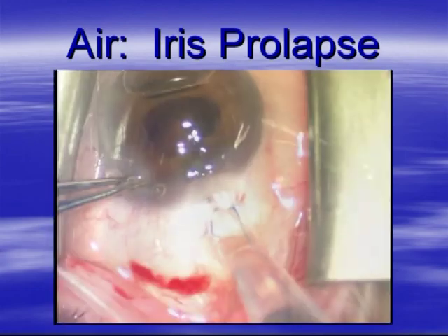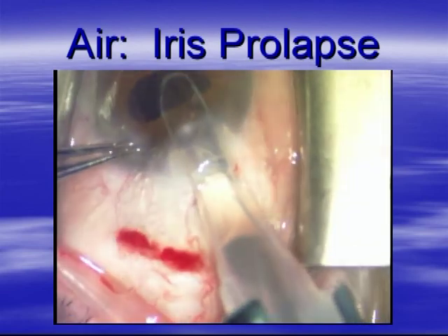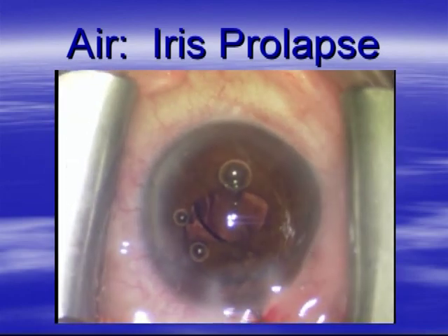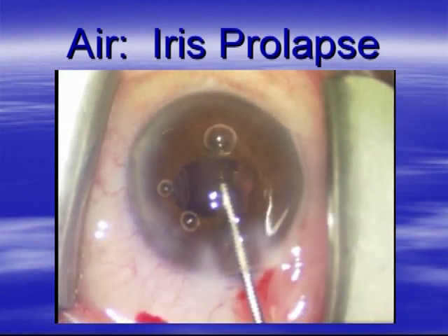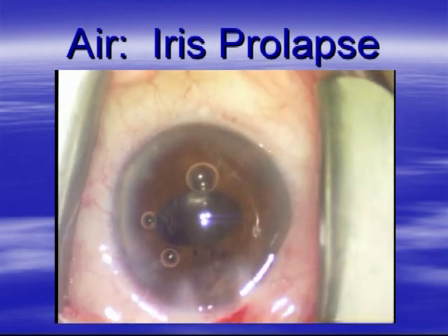We put the tip of the injector in, rotate it appropriately so we don't incarcerate the iris or catch it as we inject the IOL. And the IOL goes into the capsular bag, not in one step, but very good. And now we can actually manipulate the Lester hook, put the lens in the bag without any difficulty. And this is really going to be the test. I've got to get the viscoelastic and the cortex out.